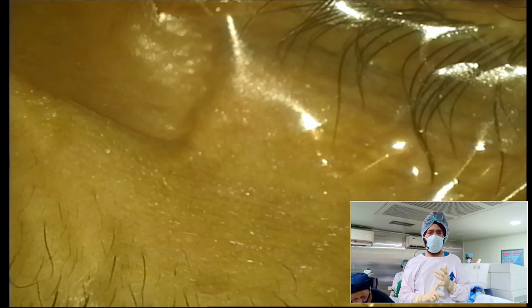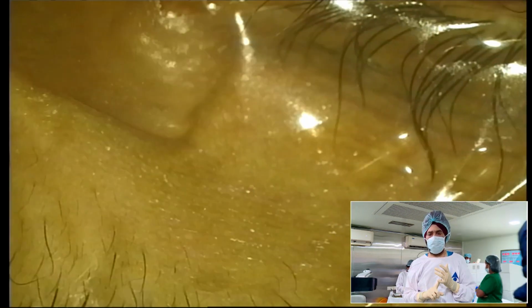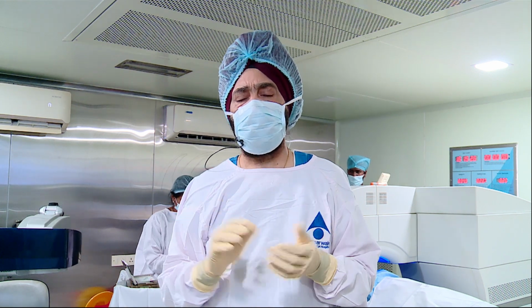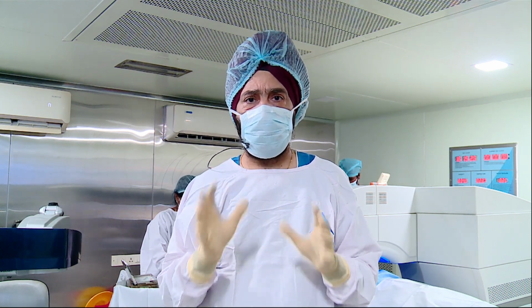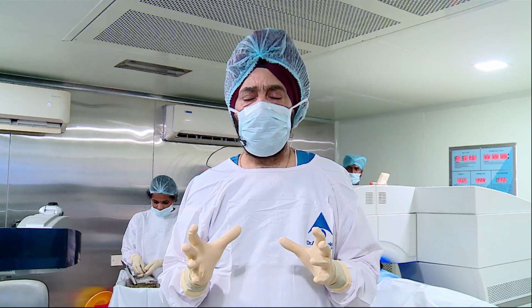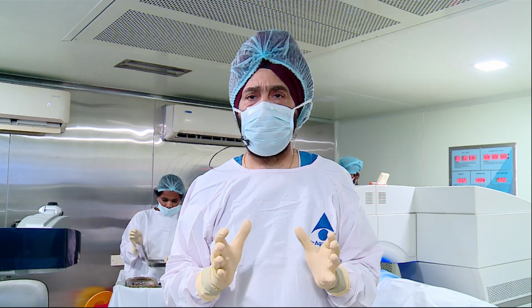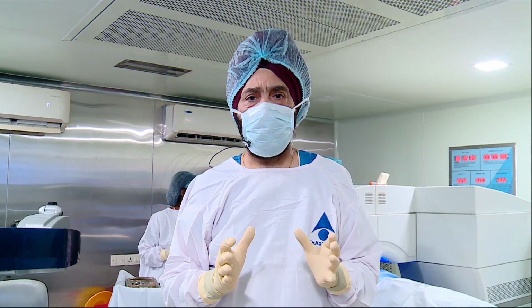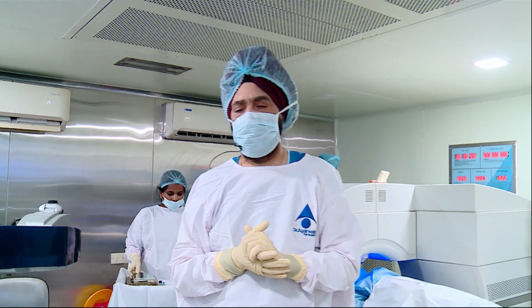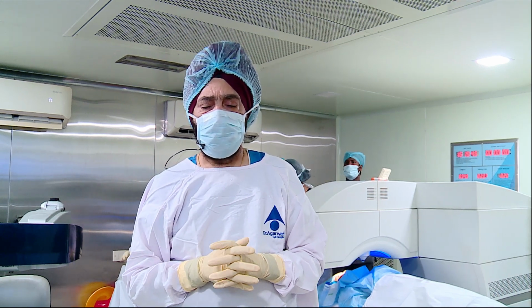So that is the other thing. You should not have too much fluid. That is something very important. Though a dry cornea is going to cause cold spots, so you should have just adequate moistening of the cornea and not too much. The speculum should be adequate to open the eyelid so that there isn't any undue pressure on that, and the patient's head can be held slightly by you so that the patient doesn't give a jerky movement. So these are a couple of things that we would wish to say as regards the loss of suction.